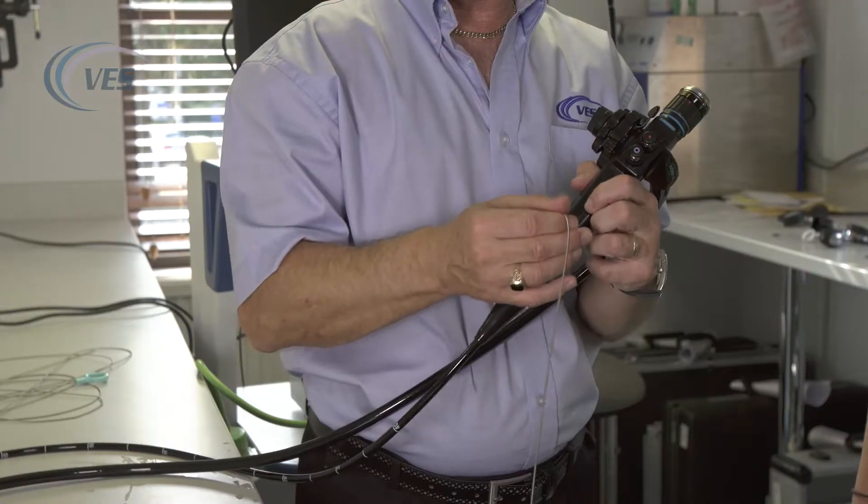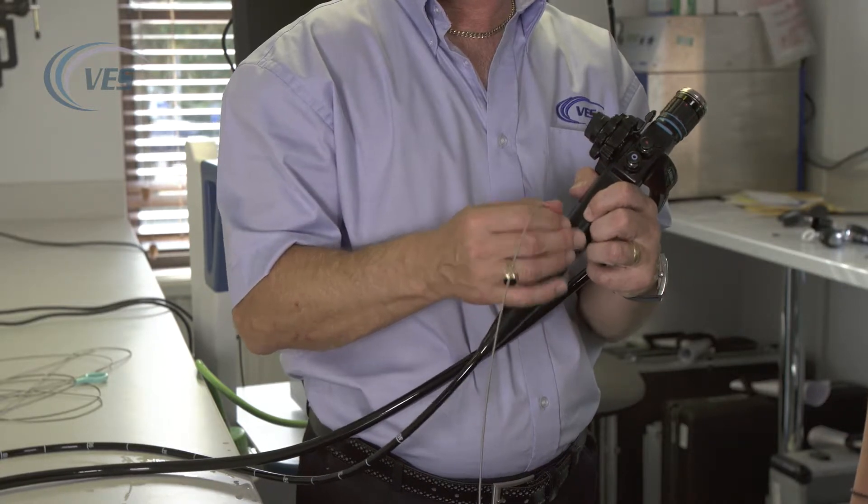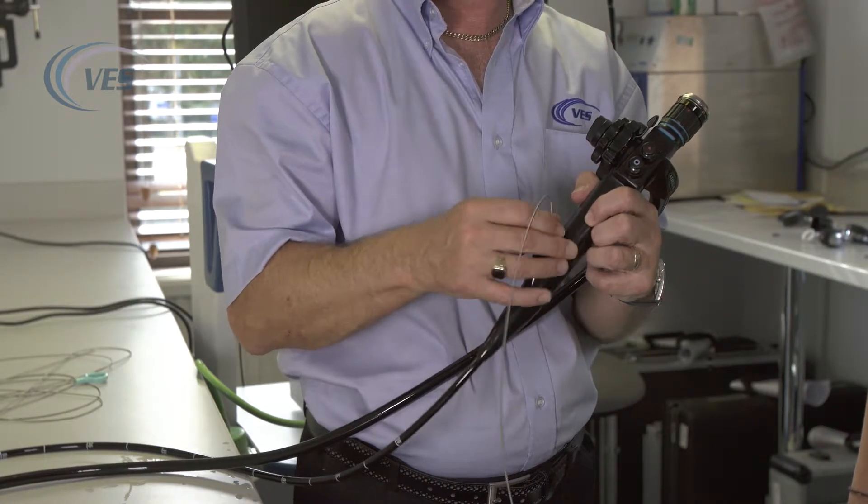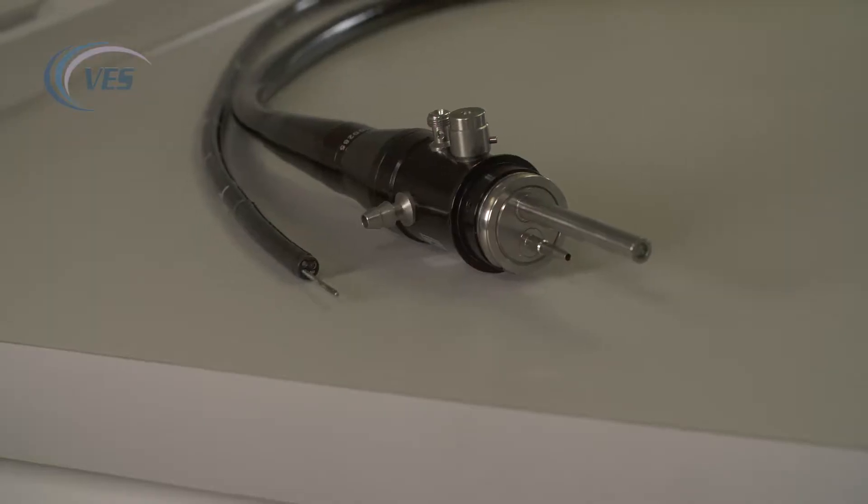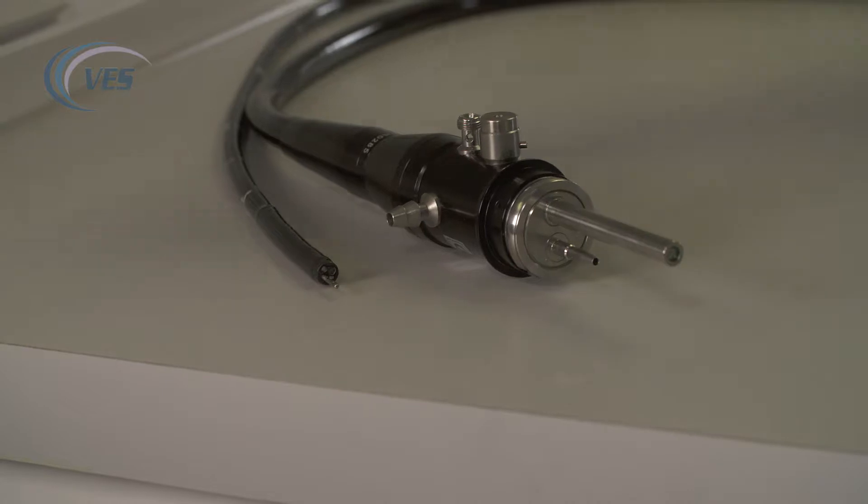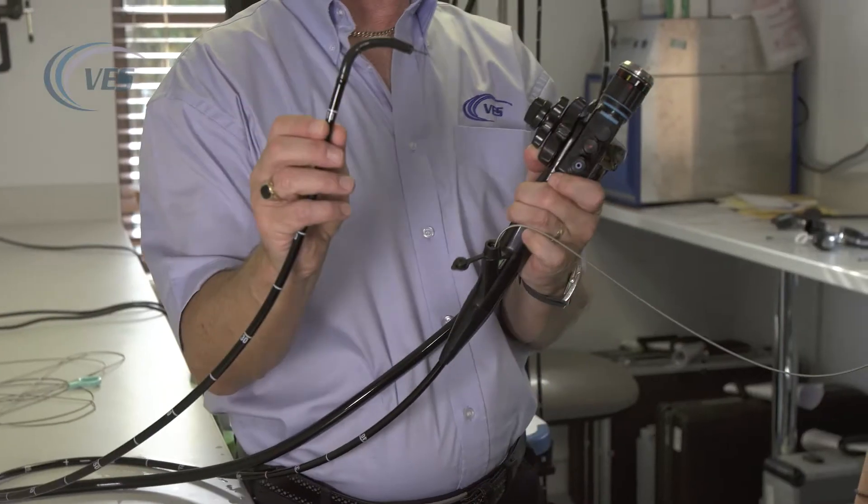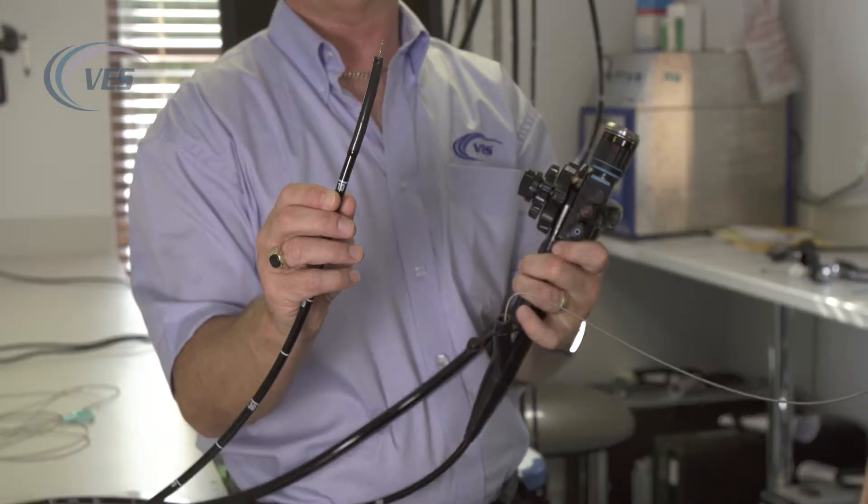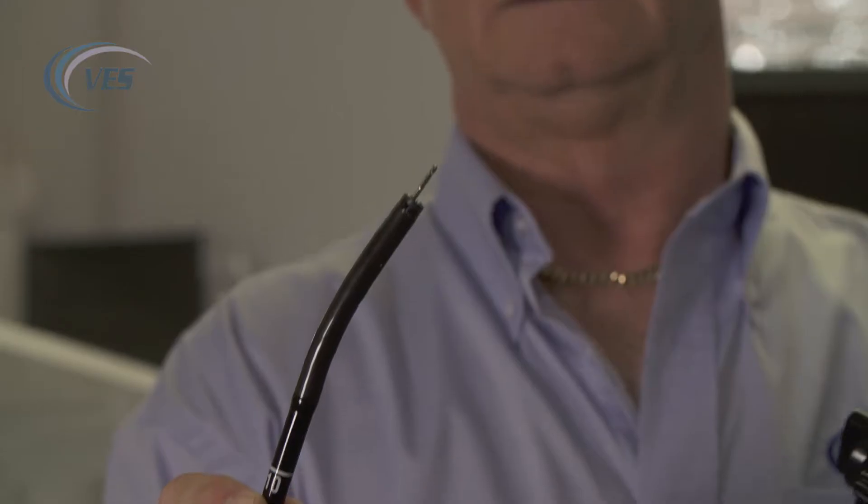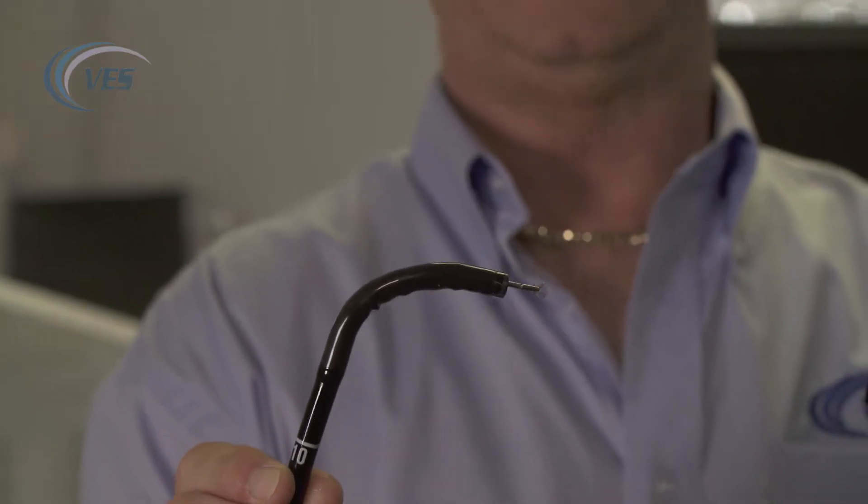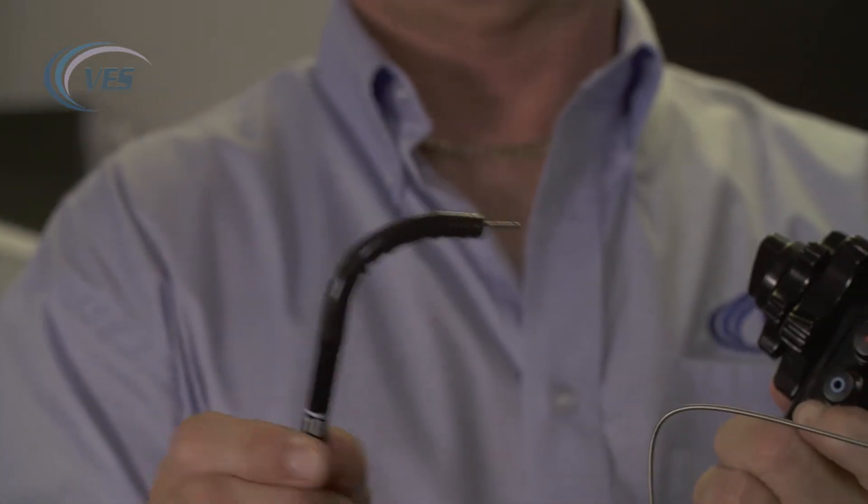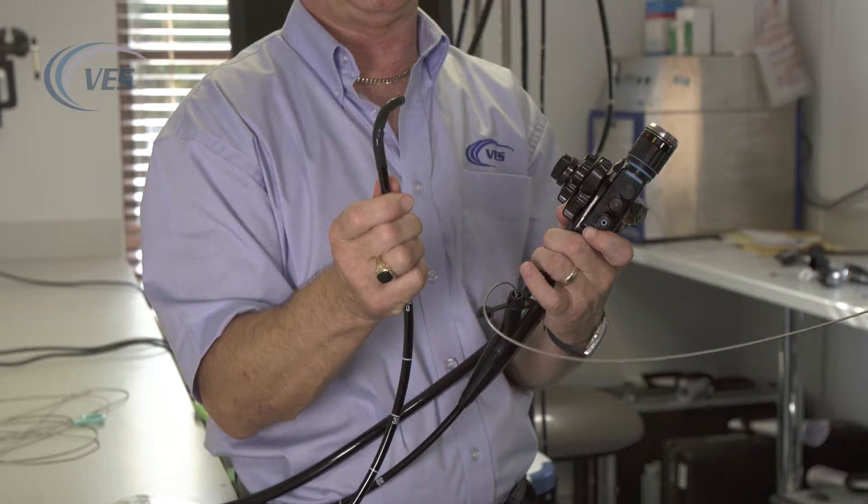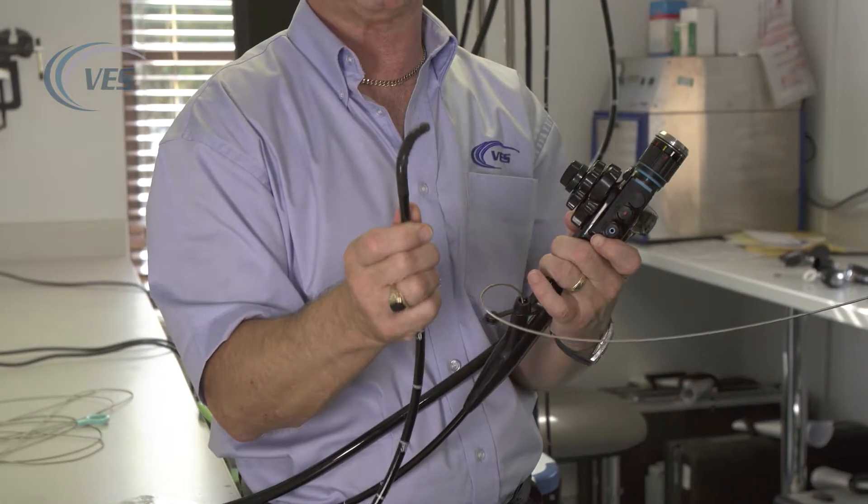Once you are in patient and introducing your forceps, once you come through the tip, you can manipulate the tip to any angle that you like. Then you can open your forceps and then close your forceps and grab. That takes your actual biopsy step.